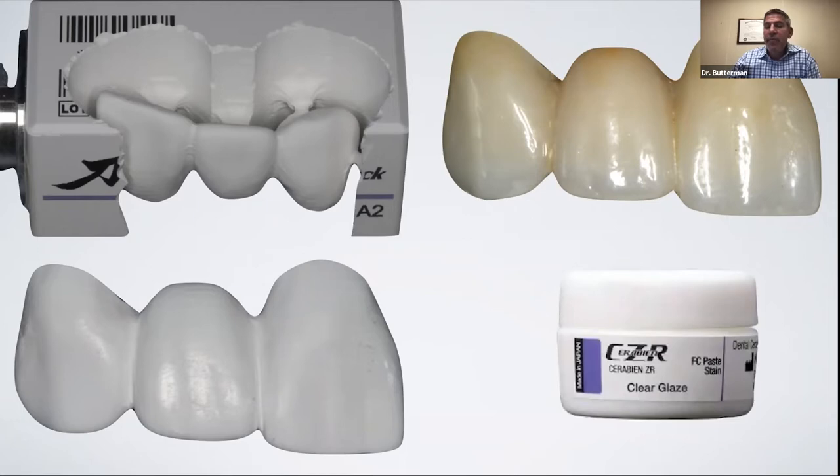So if you haven't played with this stuff and you want to start getting into Katana for more aesthetic restorations, this is kind of a requirement as far as I'm concerned. Pre-polish and polish only for all of my posterior restorations. But as I start moving into more of a cosmetic look, then I do want to use a glaze with a little bit of stain on top of that.